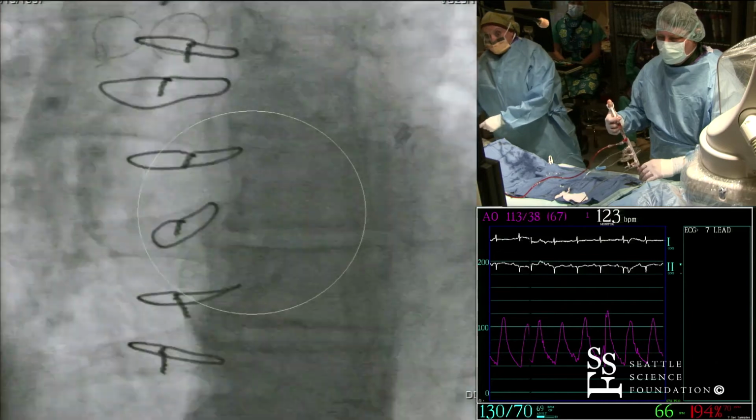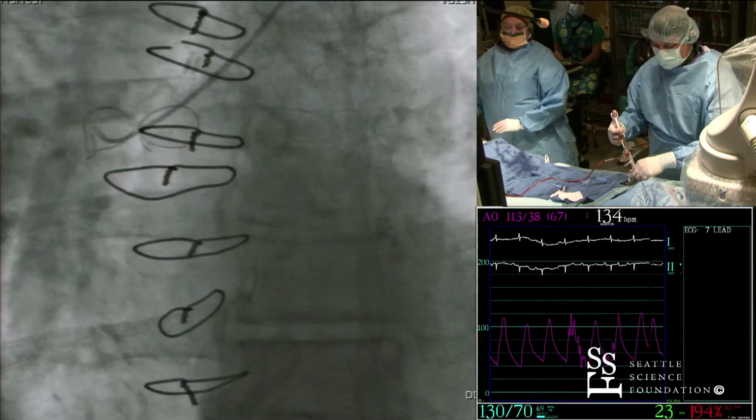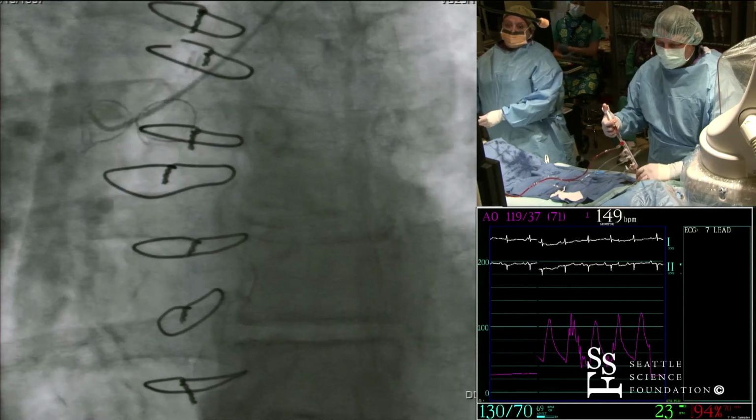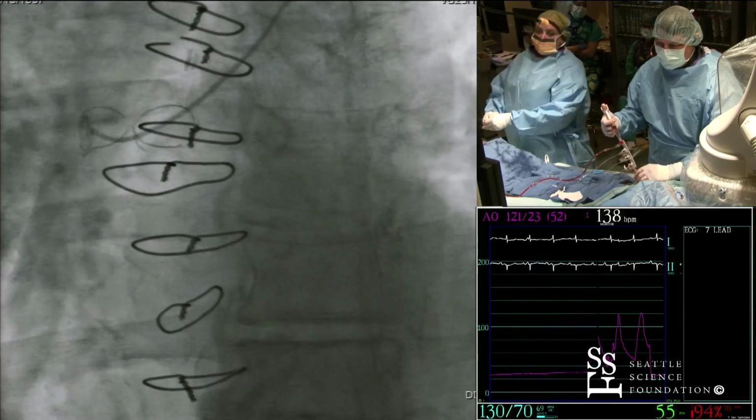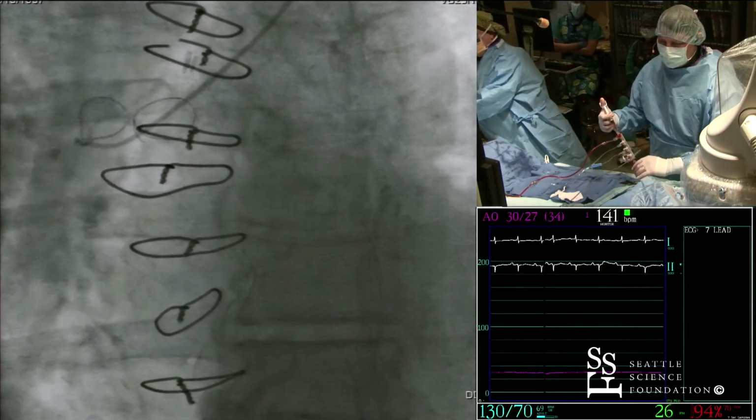At least the surgeons were nice enough to mark the grafts. The question is, will I need a multipurpose to get into this or not?